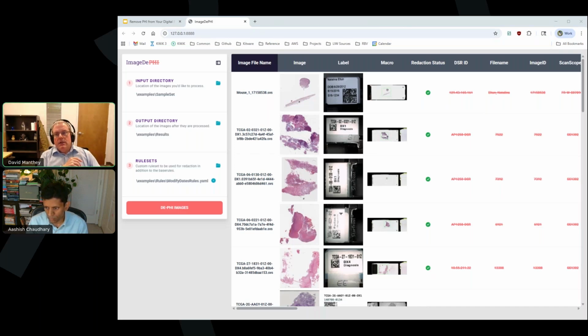And then the other question we had was about the file we showed earlier where we had those extra image descriptions, which our software definitely would get rid of. The question, for people who can't see it, is whether the PHI we showed earlier with the hex dumps would survive when we rewrite those files, regardless of how many times another piece of software wrote it badly. Because we completely rewrite the file, whether we're doing TIFF or DICOM, we rewrite the file and all of its parts, and we only put in the data we want.